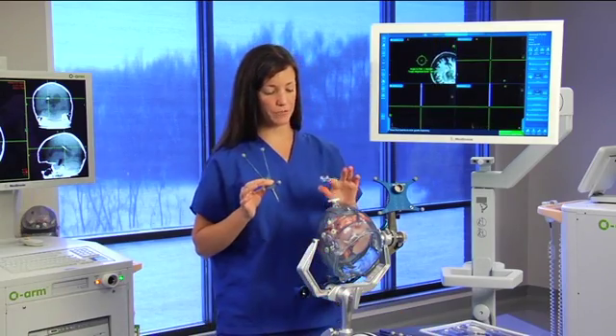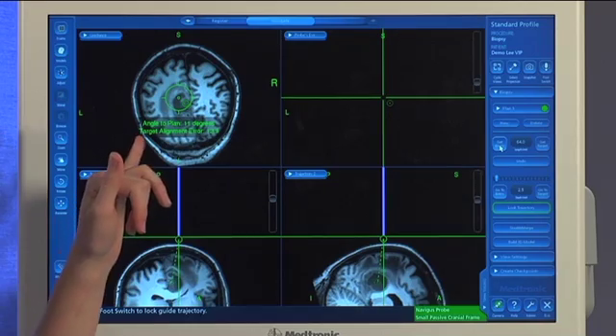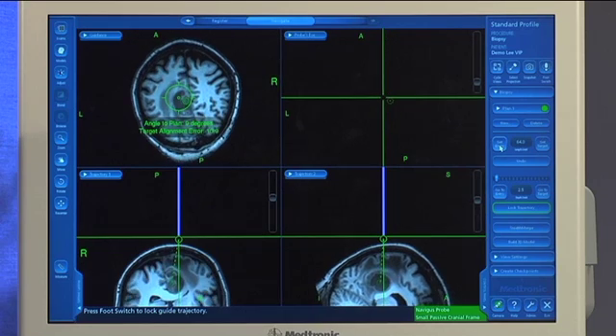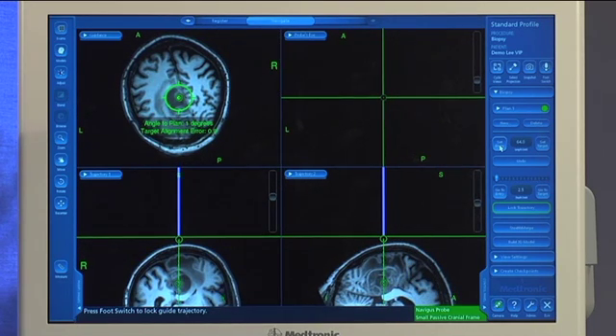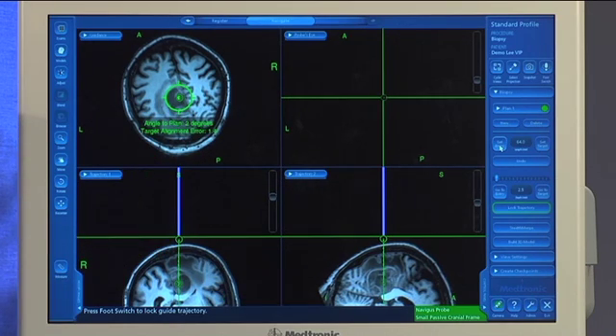The Navigus probe fits right down in the guide stem. At this point, what you want to do is get that target alignment error as small as possible. Ideally, you're looking for anywhere under 2 degrees. You'll notice that when I get within 2 degrees, this guidance view is going to get brighter so that you can actually see it and know that you are within that 2 degrees.